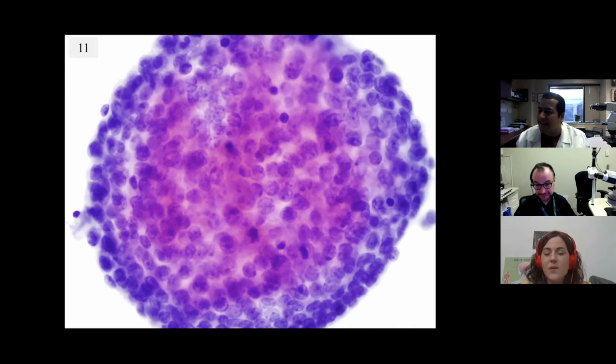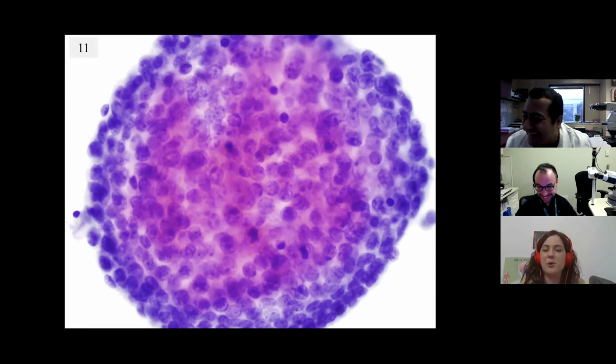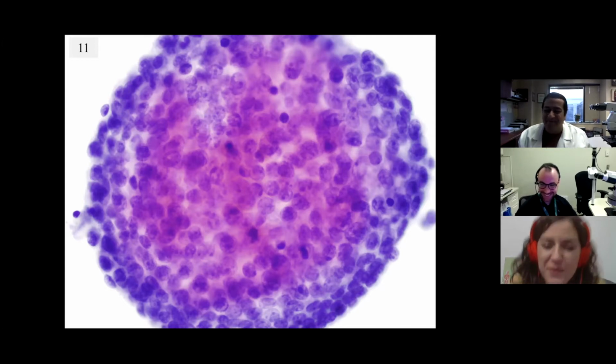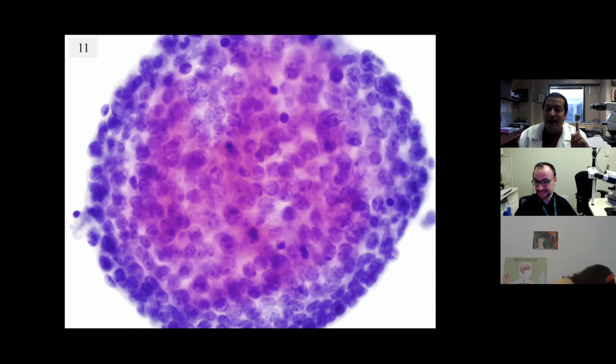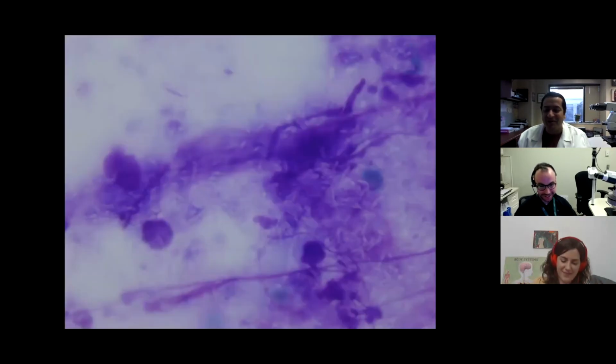Cool. I was thinking a meatball. What's that, Irene? A meatball, like spaghetti with meatballs. Delicious. That's spaghetti and meatballs, and that comes into play in pap smears, but we'll come to that some other day. Okay, breast cancer. All right. So this is not a spotter because clearly it's not easy enough. I'm sure it's a spotter for cytologists. Okay. Let's go to another one.